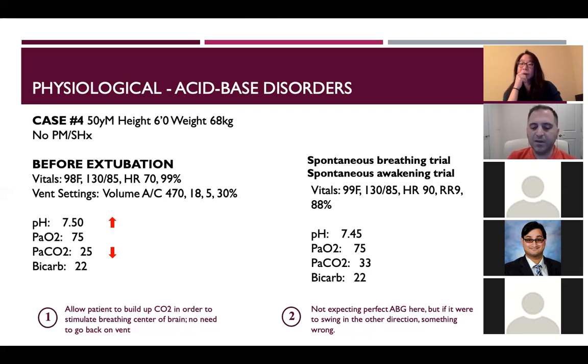So if you give them a little bit more time for the CO2 to accumulate, then their brains would kick in. So you're essentially downgrading them in terms of support to stimulate them to breathe again. To Victoria's point, not just the numbers that you're manipulating, but in totality of ventilation, you're also adjusting how much support you're giving, if it makes sense.